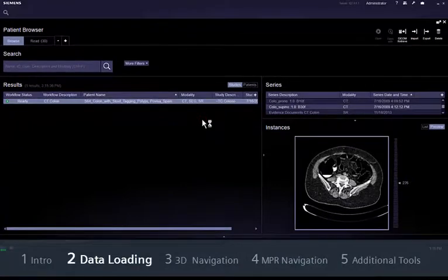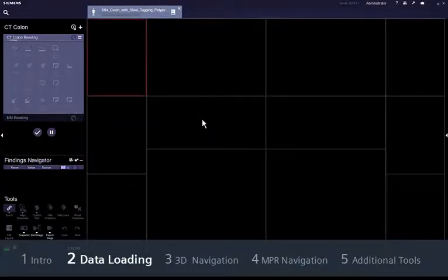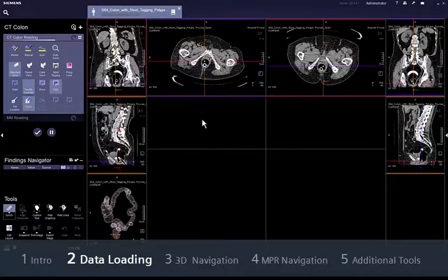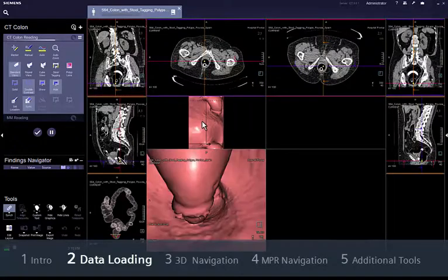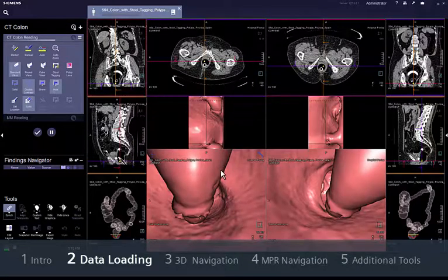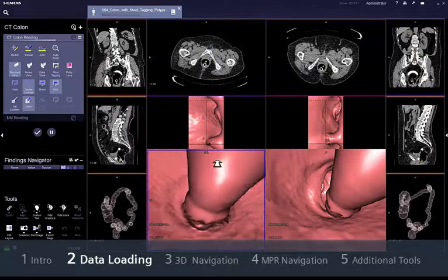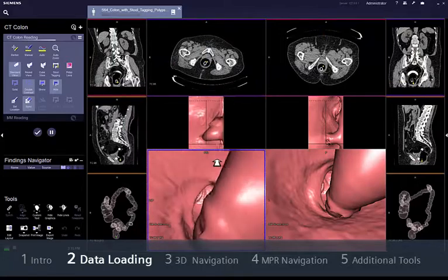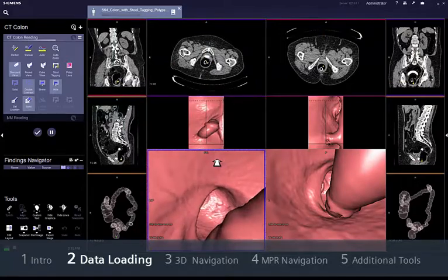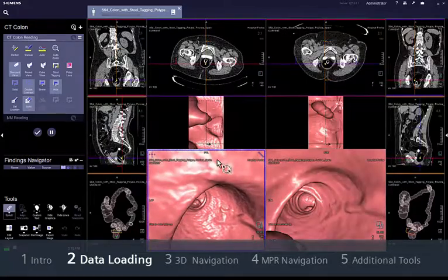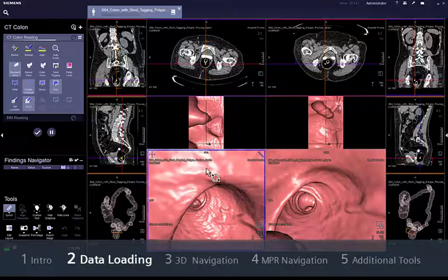Syngovia automatically pre-processes the data and arranges the images in your preferred reading layout and order. It also automatically segments the small and large bowel and synchronises endoscopic navigation between the supine and prone data sets.